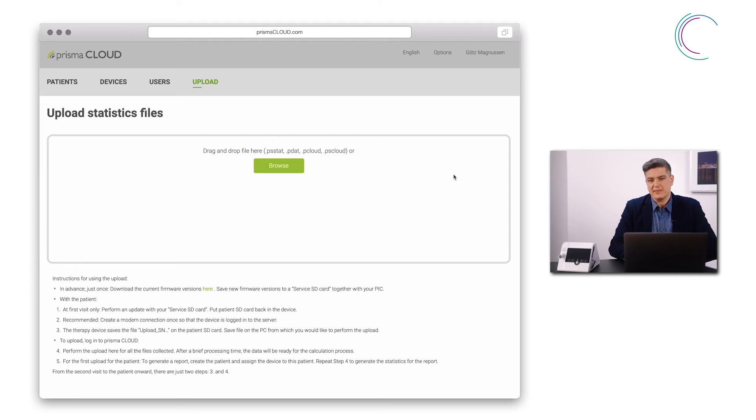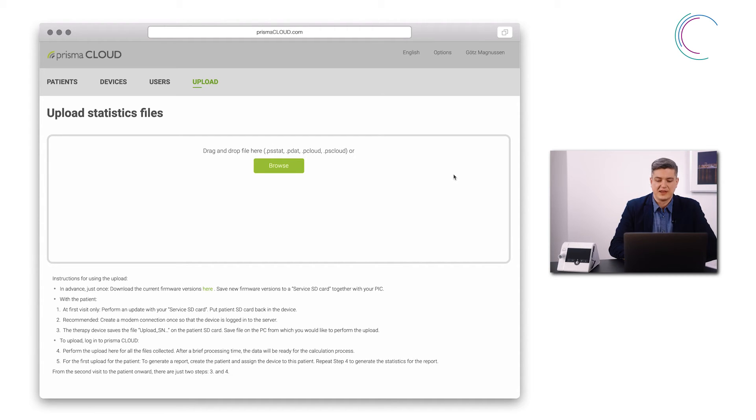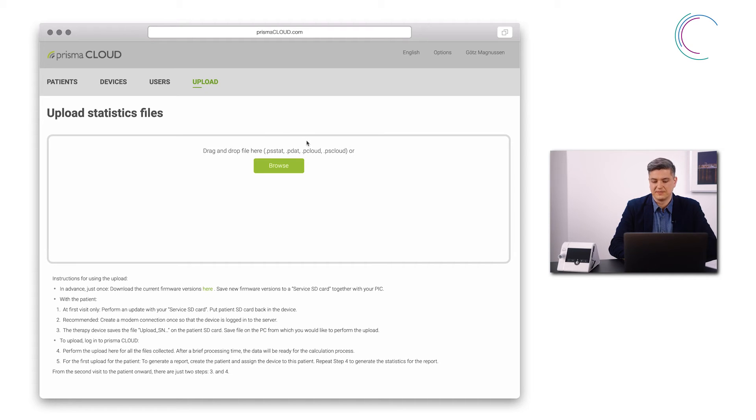Next step is to select the right statistics file from the SD card. Please make sure that you will look for one of those file extensions here. In general, they will be named with P Cloud or PS Cloud.